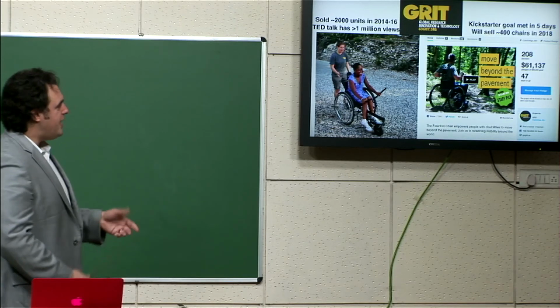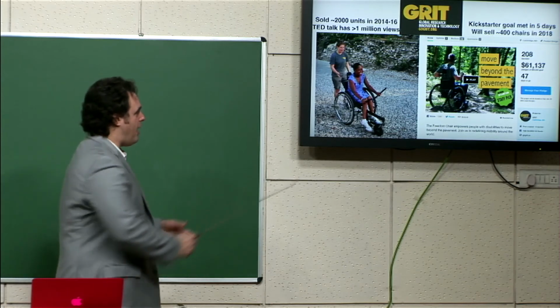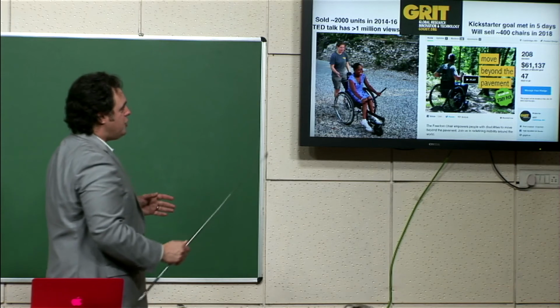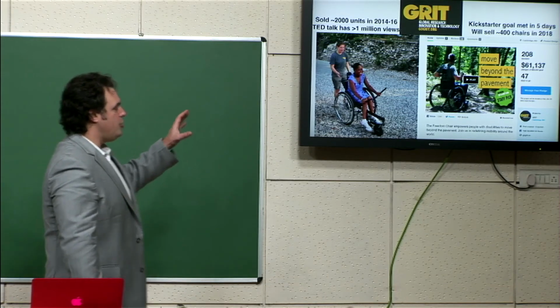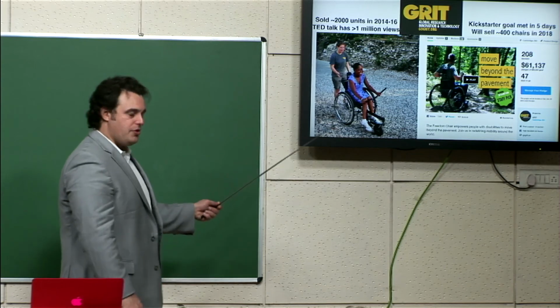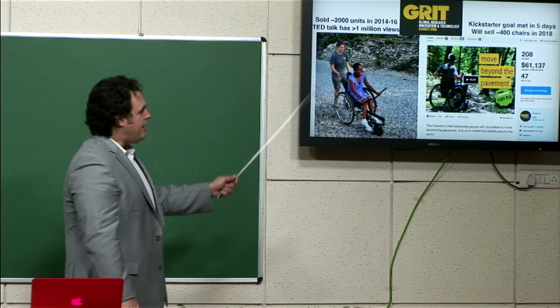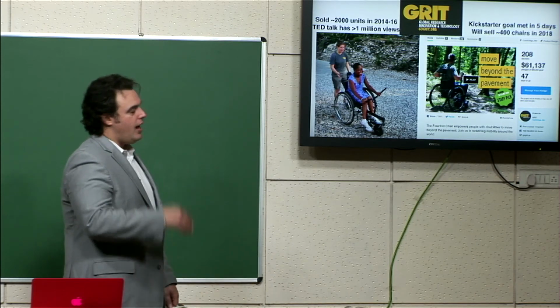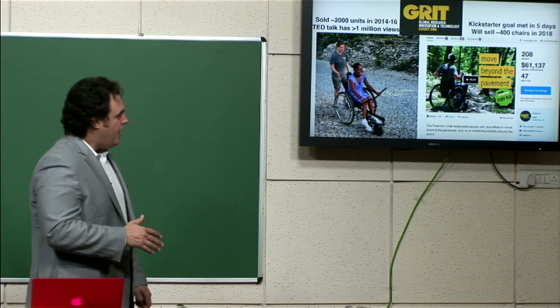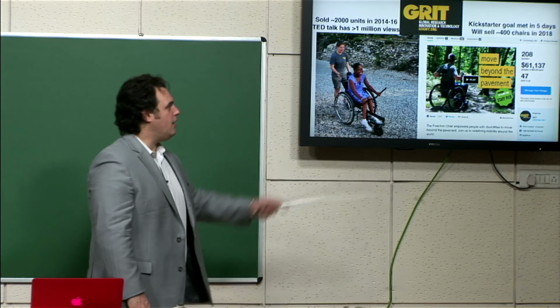And what we set out to try to do, and I'll tell you some more about how we weren't as successful as we wanted to be here, is make a business where we do high volumes and relatively lower margins in the developing world segment of the market, and this is the chair that was made in India. And then in the US market, do a higher price point and higher margins, but lower volumes. And so this chair is doing pretty well.